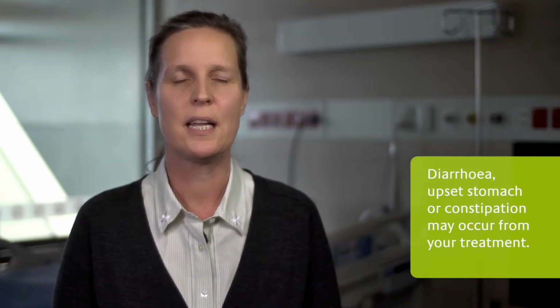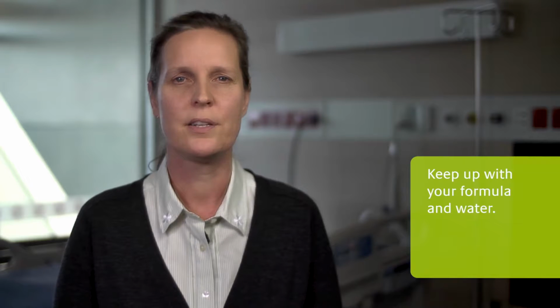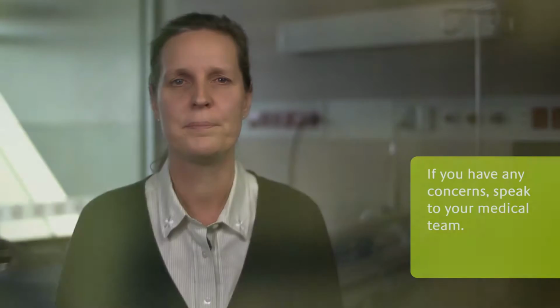Patients may experience problems, for example diarrhea, an upset stomach or constipation. These are usually not caused by the tube or the formula. Try to keep up with your prescribed formula and water. Speak to your medical team about any problems you're experiencing so they can help you.